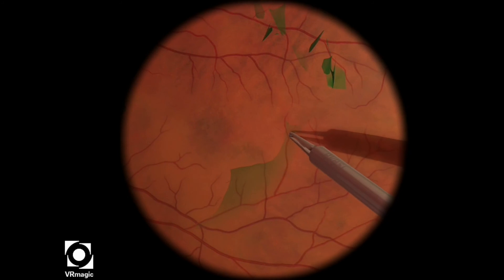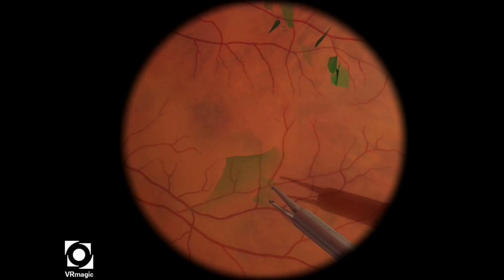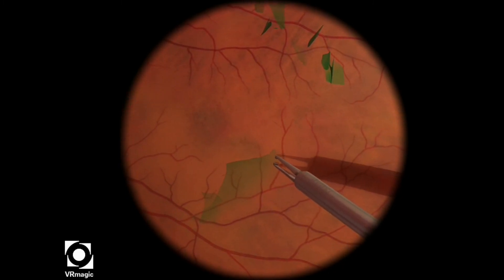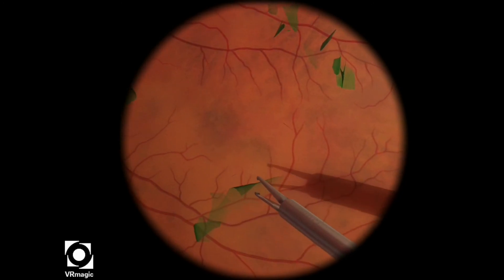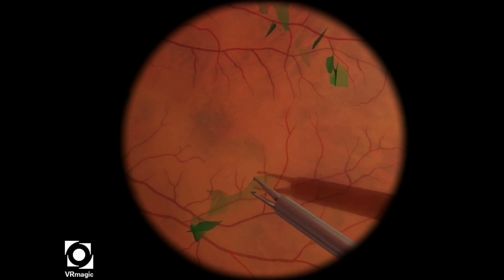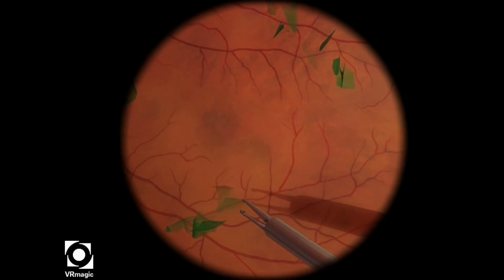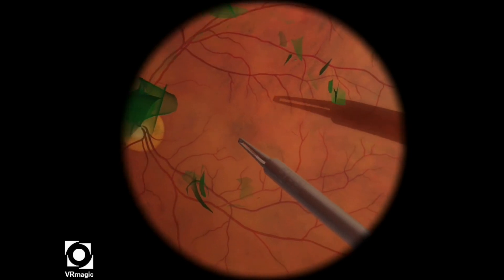I'm grabbing one small piece here, and then I'm just able to continue peeling the remaining ILM. You can see here it's just small little grasps, and I'm just cleaning up the rest.